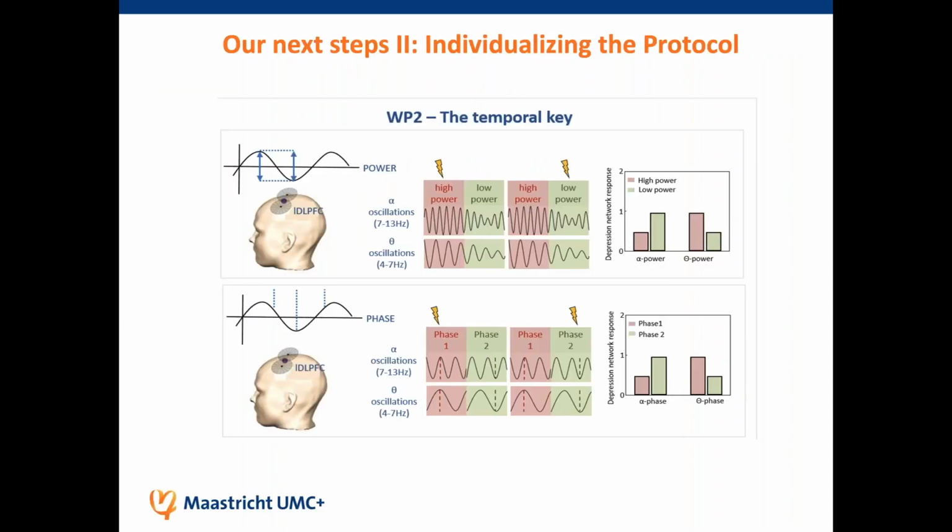But my point is that this is great towards personalization, but it's not enough, because what I showed you before tells us actually that even if you're on the perfect spot that is anti-correlated or correlated to your actual target deeper in the brain, by just randomly giving any kind of rhythmic activity, you are running the risk of not having the TMS pulse being robustly sent and propagated to your actual target, because you are ignoring the communication frequency with that network.